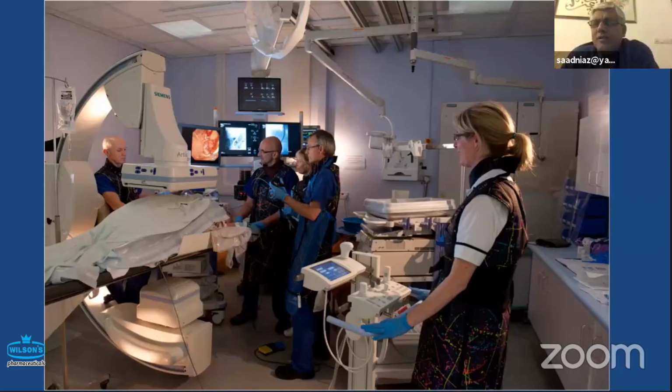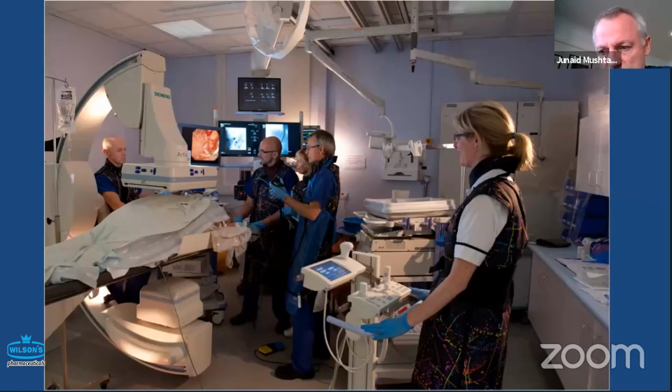Yes. So I think that doing an ERCP is actually helpful, or doing a duodenoscopy and going down and evaluating. The endoscopic ultrasound will help to see visually, does it look like an adenoma? Does it look like an adenocarcinoma? And it will also be able to stage. The ERCP will be able to get high resolution endoscopic images, and it'll be able to evaluate whether it looks like cancer. And yes, of course, you can take biopsies.